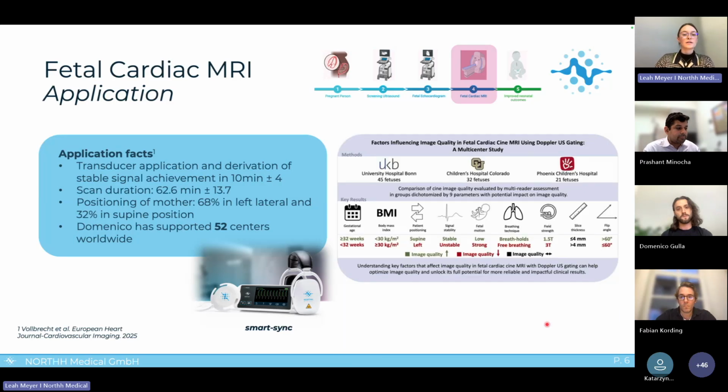In this context, I would like to highlight a great multi-center study between University Hospital Bonn, Children's Hospital Colorado, and Phoenix Children's Hospital, with a very high number of 98 fetuses included, demonstrating which factors lead to the best image quality, looking, for example, at gestational age, positioning of the mother, or even breathing techniques.